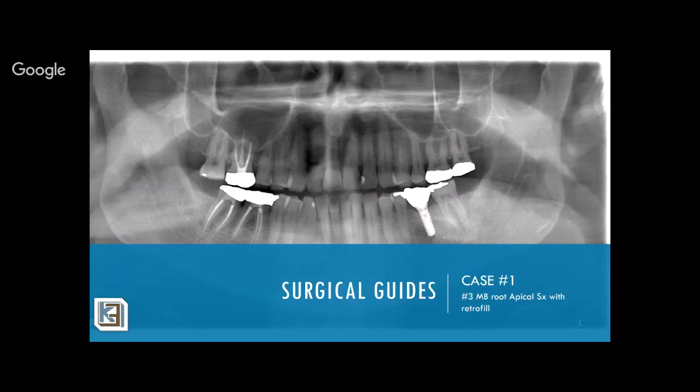True, but remember when I was showing the picture of the three first drills and their drilling shaft, part of the drilling shaft is 1 millimeter in diameter. That stays 1 millimeter in diameter throughout the length of it. So as you go deeper, that 1 millimeter binds in the walls and acts as an internal guiding plane within the tooth itself, and it helps you stay centered.